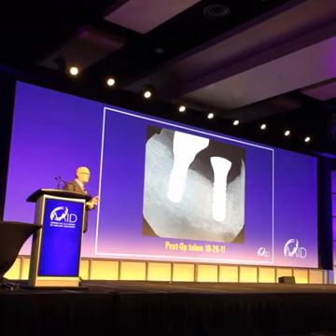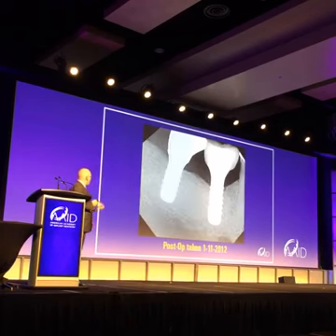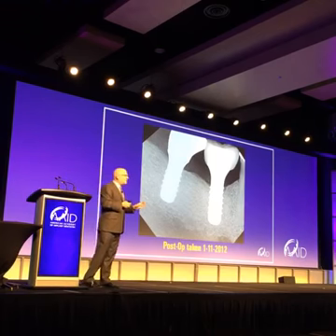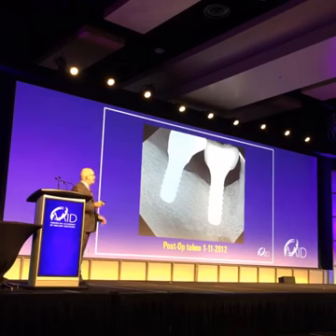No bone grafting, no membranes, no nothing. Just straight, get rid of the infection. And then it was restored a few months after that. He took an implant that every one of us would have taken out in a heartbeat and saved it, because he knew he couldn't get further behind. He could only get ahead.